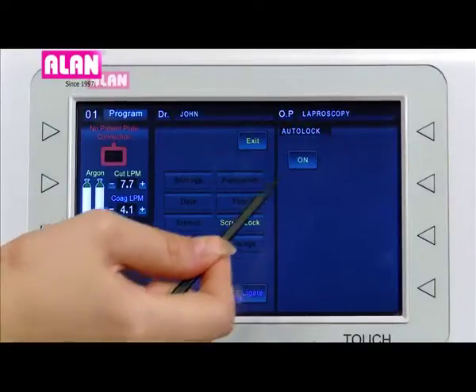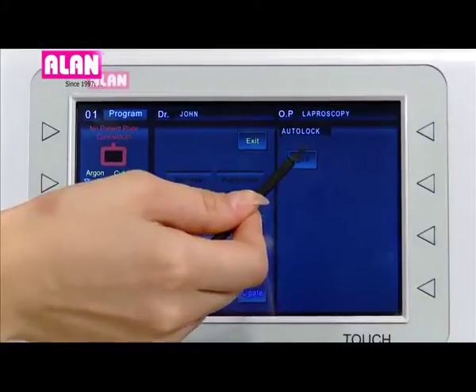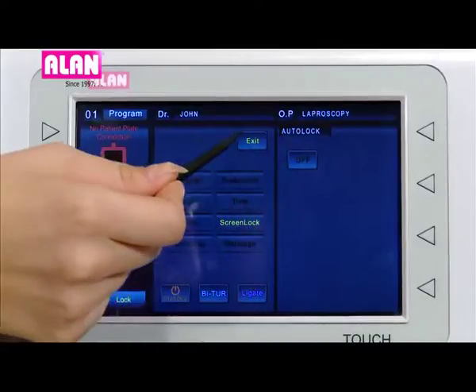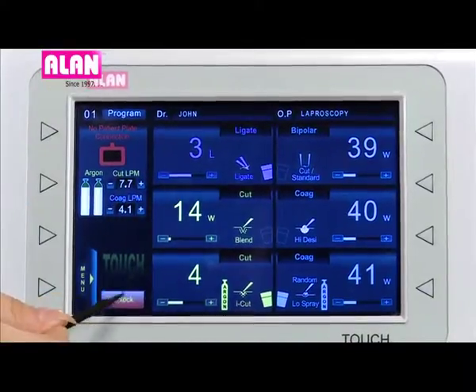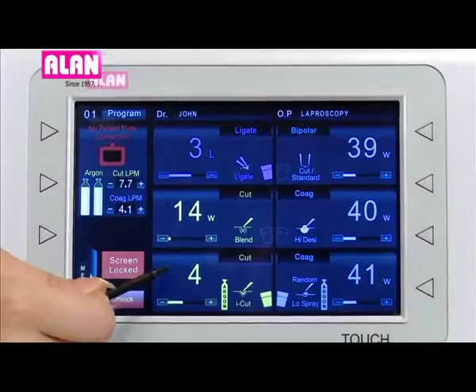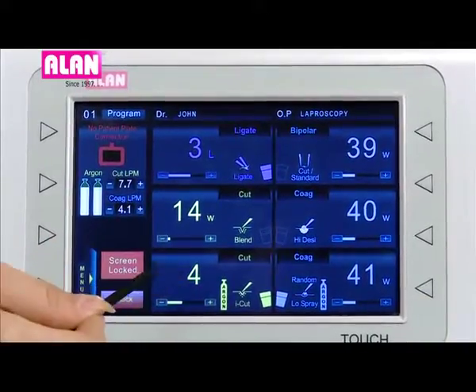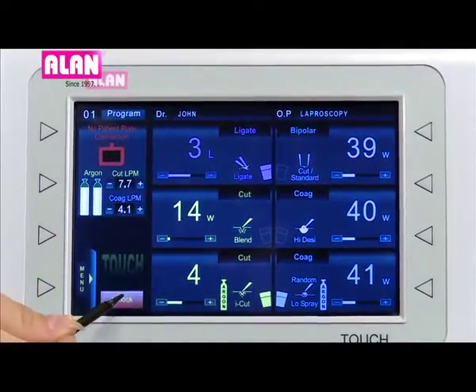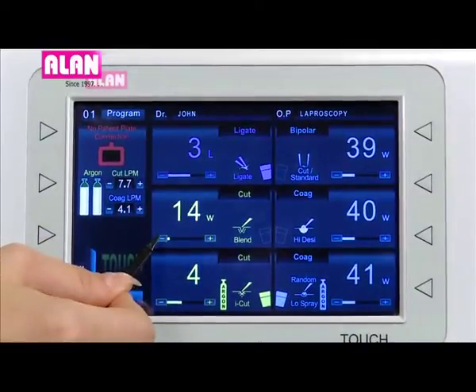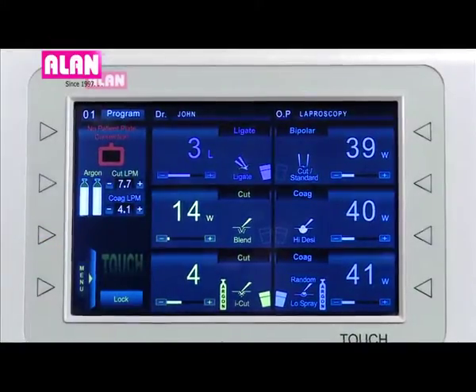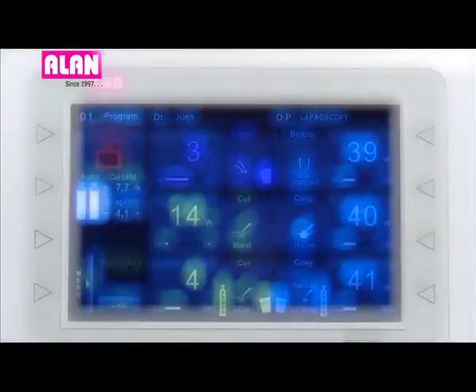In the screen lock section, auto lock enable and disable options are available. If auto lock is disabled, a manual lock icon will be provided to manually lock and unlock the screen. Once auto lock is enabled, the screen will be locked automatically after 2 minutes.